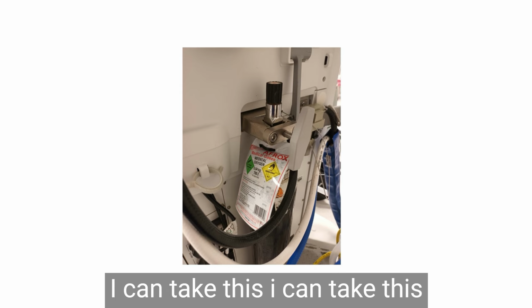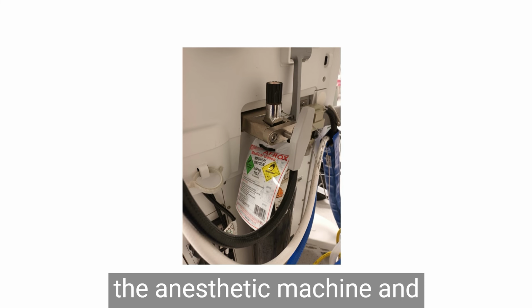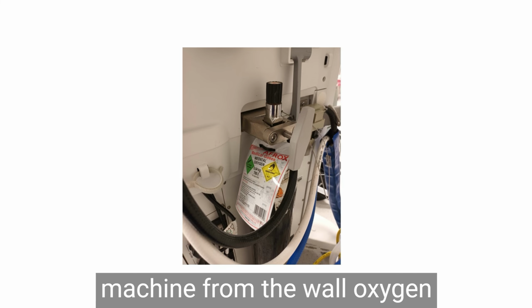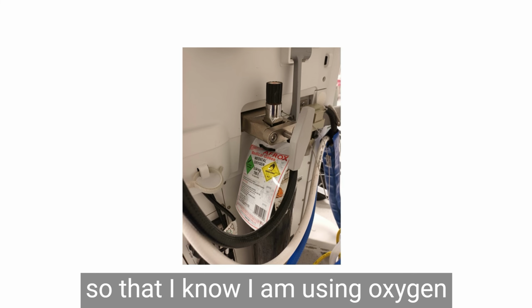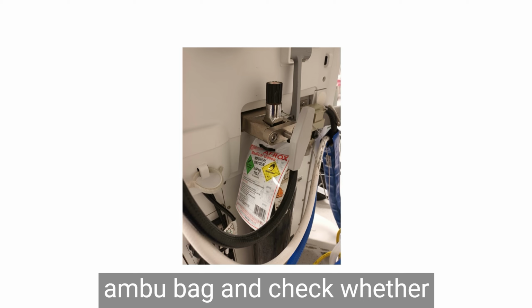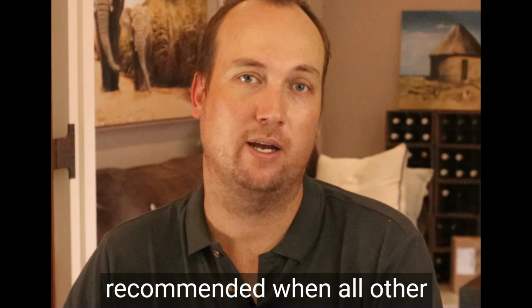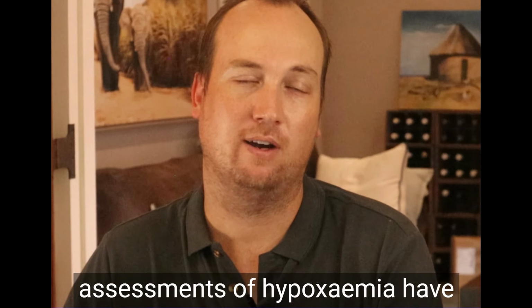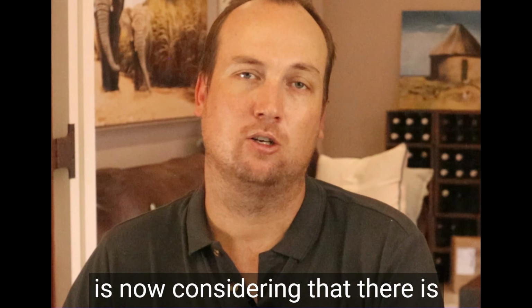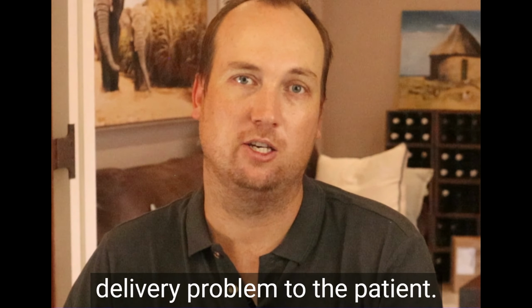I can take this even further and then open the oxygen cylinder at the back of the anesthetic machine and disconnect the anesthetic machine from the wall oxygen so that I know I am using oxygen from the oxygen cylinder via the ambubag and check whether that improves the situation. And this would be recommended when all other assessments of hypoxemia have failed to reveal the cause and one is now considering that there is a piping problem and an oxygen delivery problem to the patient.